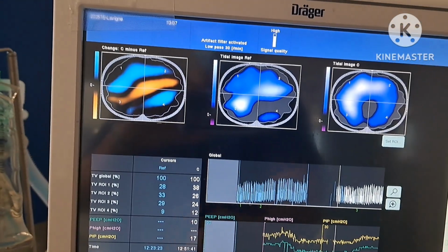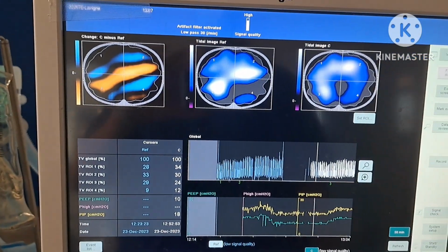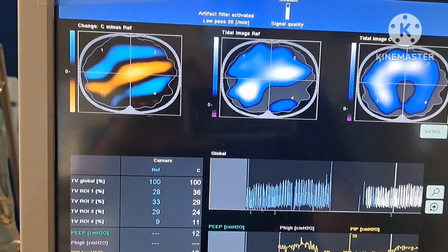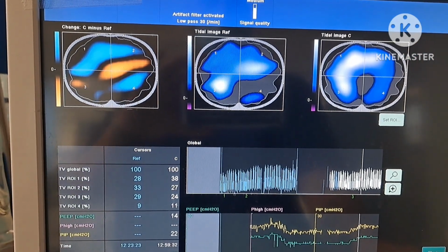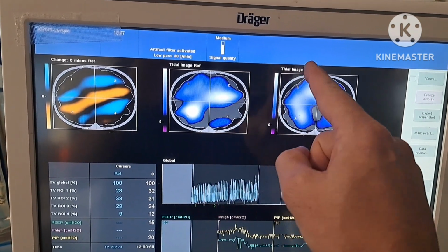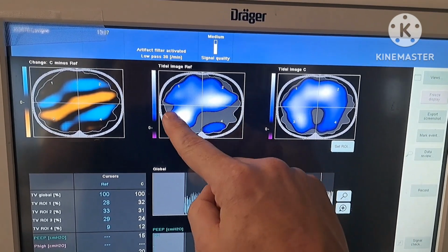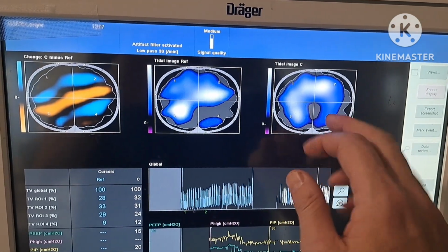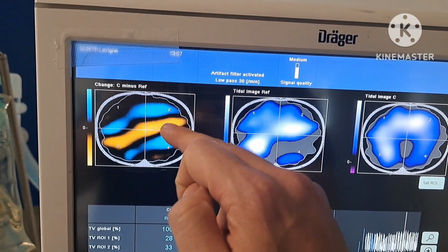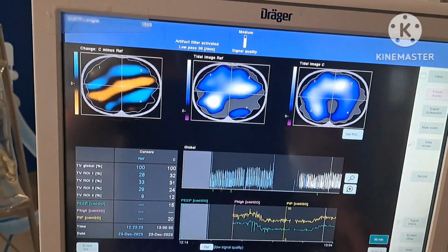And then after, we're at a PEEP of 10. And the PEEP of 10 is holding region 4 nicely open. We have 9, we're at 12%. See, it's nicely opened up. And the color code is saying that compared to here, when you're comparing this to that, you notice there's less white, there's less distribution here because it's been open there, so everything smooths out. So it's saying that air in the reference that was here has been redistributed up here and down here, making a more homogeneous ventilation. Okay.